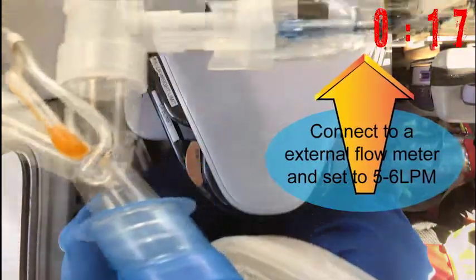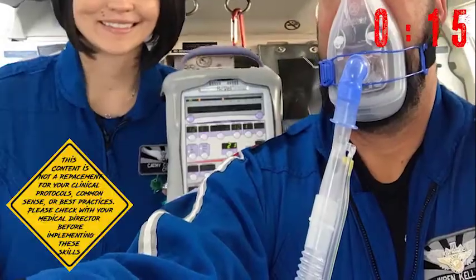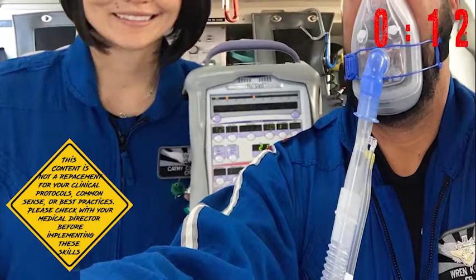Lastly, try it on your partner so they can understand what your patient is going through and how that anxiety can be created by the experience.